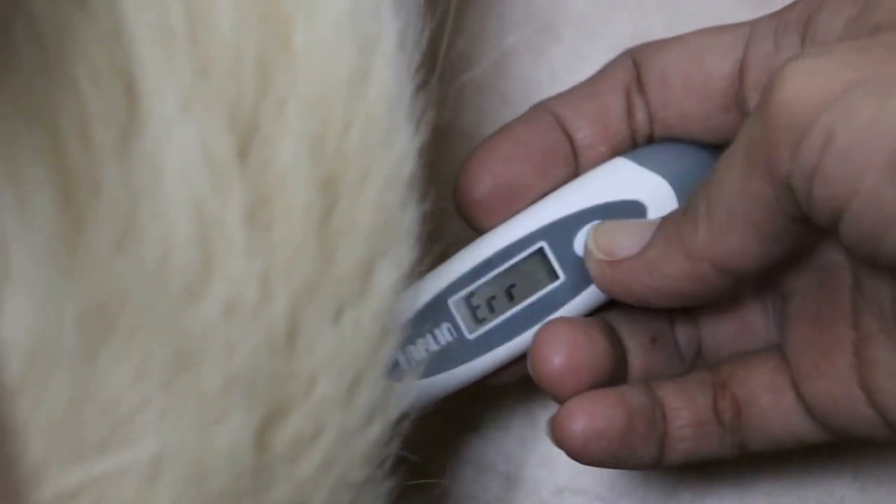Okay, zoom on the thermometer. Then you just edit this out and show that the temperature is normal.